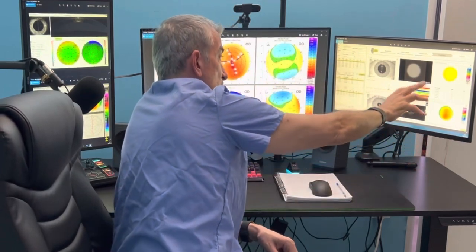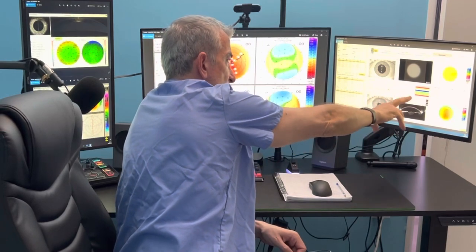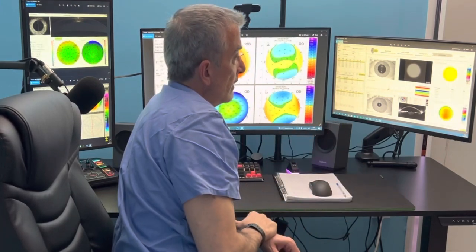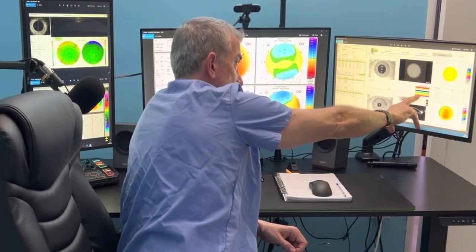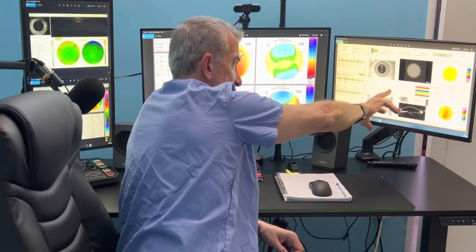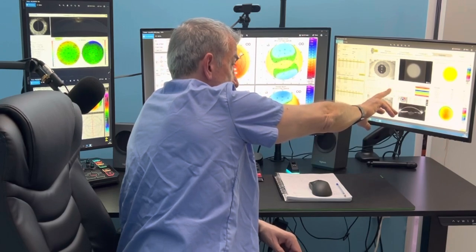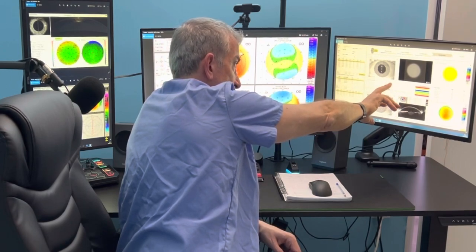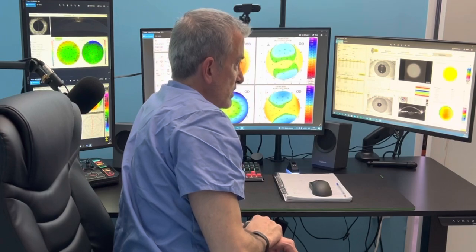This is the same patient. We're seeing that the slit-map device uses a three-dimensional eye model for each eye it evaluates, based on the actual length measurements by the interferometry device embedded in this all-in-one device. It's one machine that takes Hartmann-Shack wavefront images and interferometry images measuring each anatomic step within the eye. We can see the hyperreflectivity from the epithelium of the cornea, and also the inner surface of the cornea.